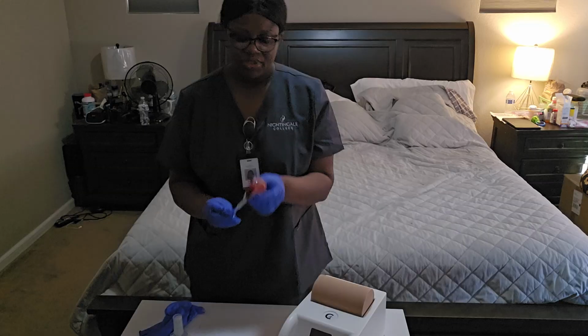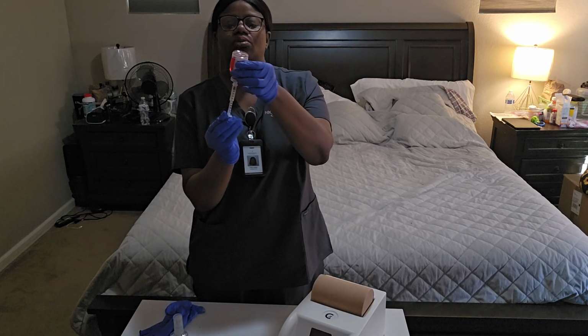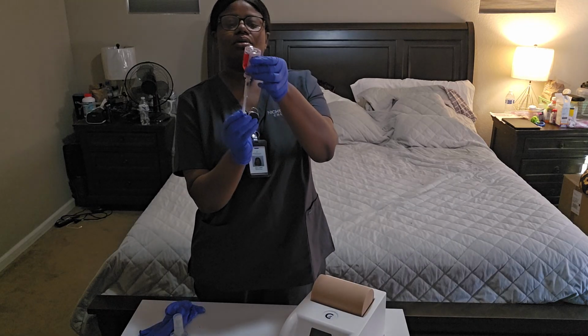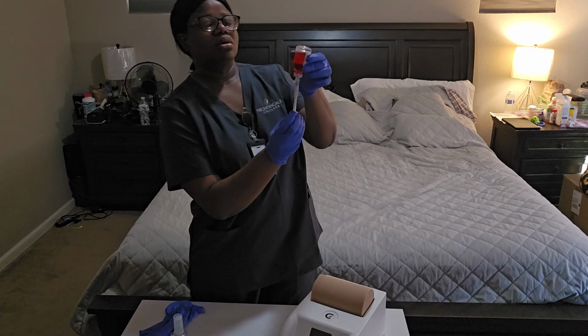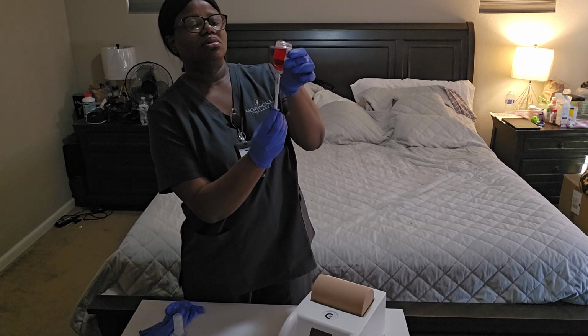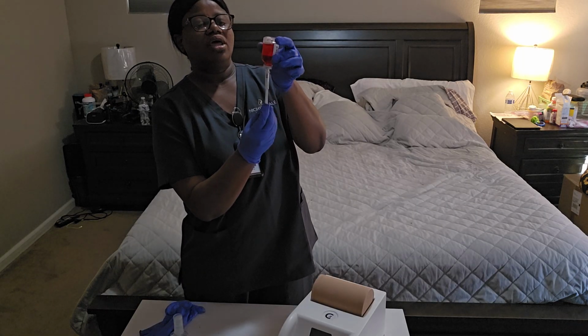I'm going to put it by the side, and I'm going to draw up 0.1 ml. When drawing up, I make sure there is no bubble, everything is good.